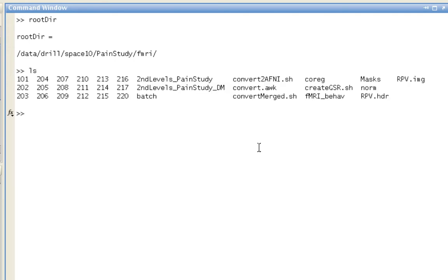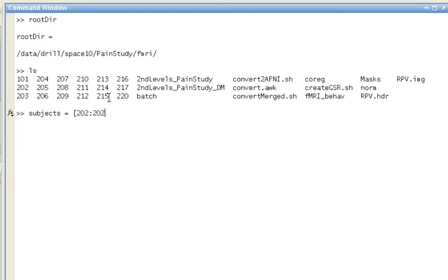That's my present directory right now, and you can see I have all these different subjects in that directory. Let's say right here that we would like to only look at subjects 202 to 205, so that's going to be my subjects variable.